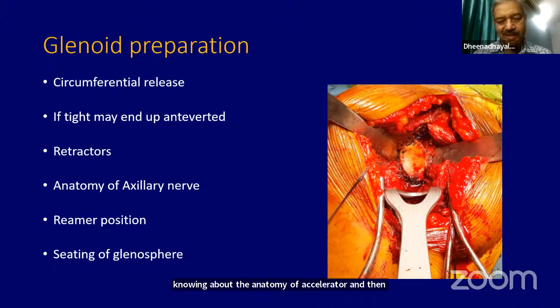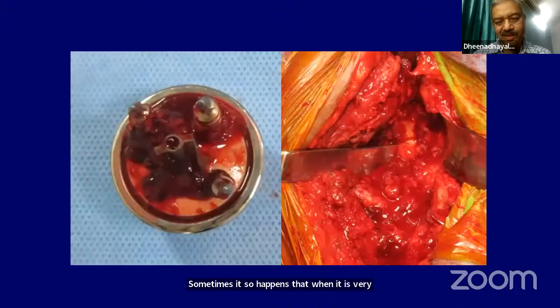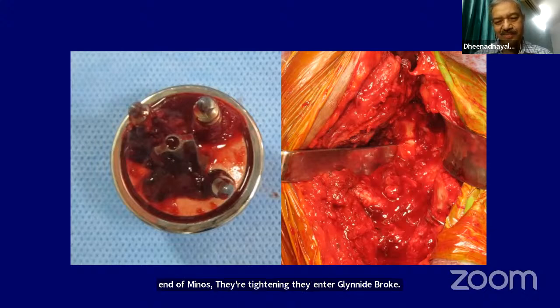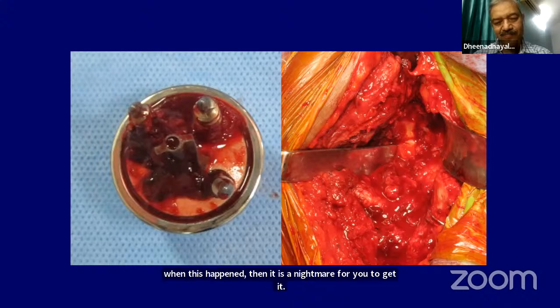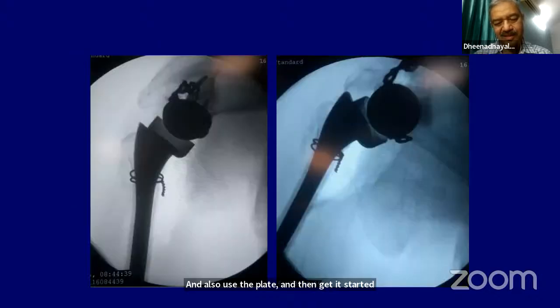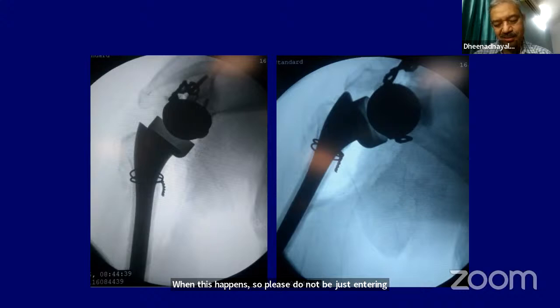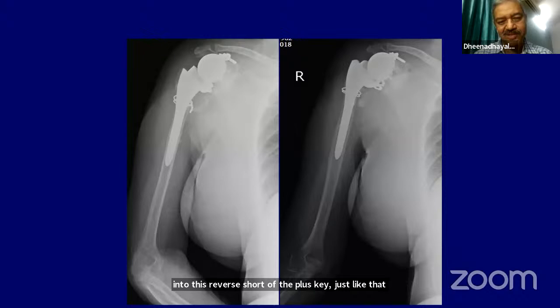The retractors must be perfectly placed such that they do not disturb any of your procedure. You must constantly know about the anatomy of the axillary nerve and the reamer position — all of these will help you to get a good glenosphere seating. Sometimes when it is very osteoporotic, at the end of glenosphere tightening the entire glenoid can break. When this happens, it is a nightmare to sort out again. Please do not just enter into reverse shoulder arthroplasty without knowing everything about it.